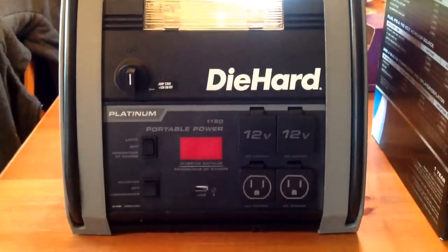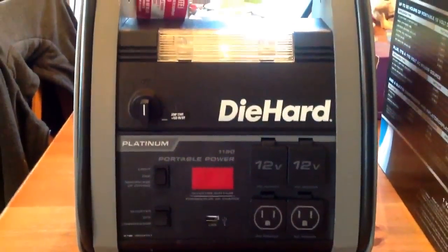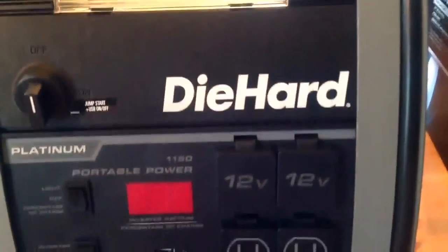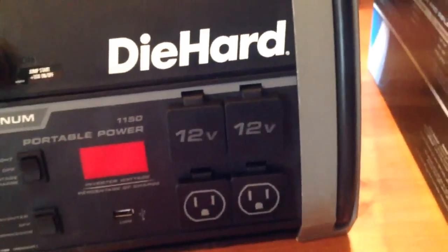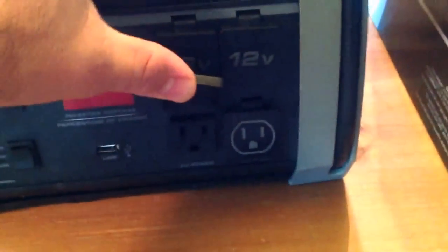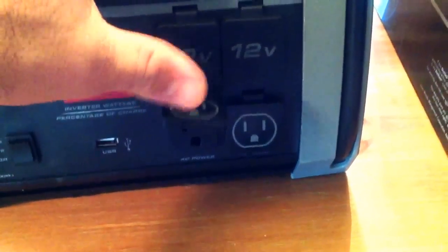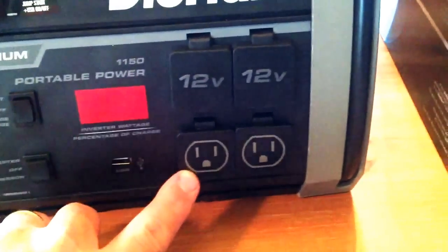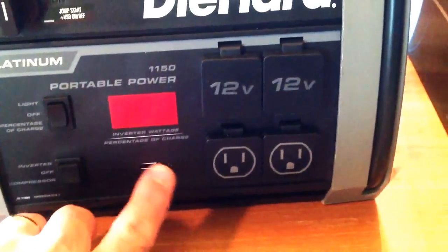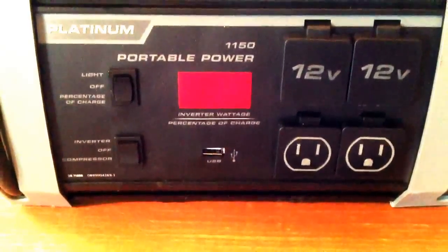It's Sears, and basically it is a portable power source. And with this device comes a bunch of different things. You have 12 volt. You have the ability to plug in a 110 thing like my CPAP machine. My CPAP machine also runs off of 12 volts, so I could use that here as well. But I could also plug in regular AC appliances, like you would plug into your house. It has a USB port, so that I could plug in, say, cell phones and charge those.